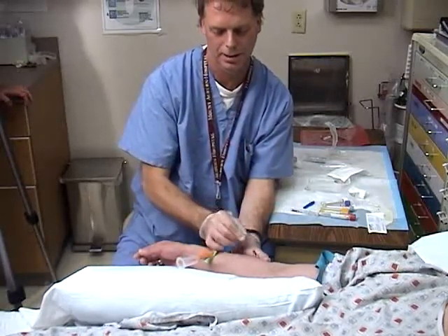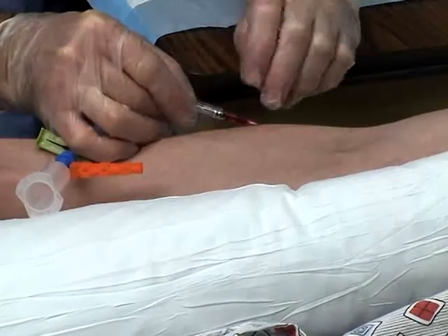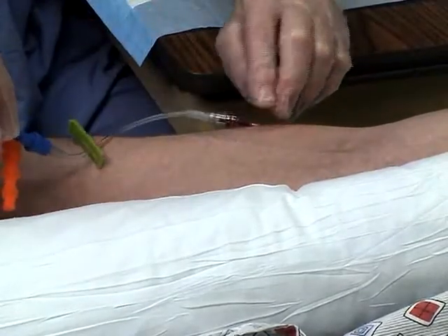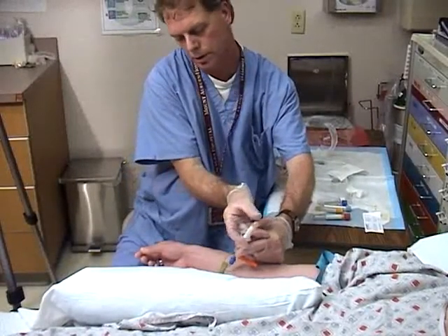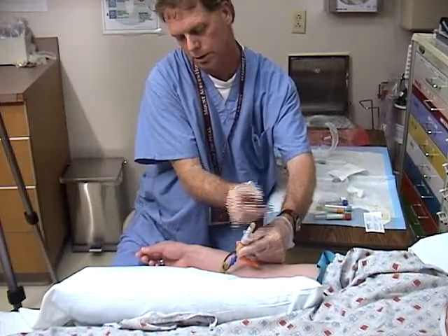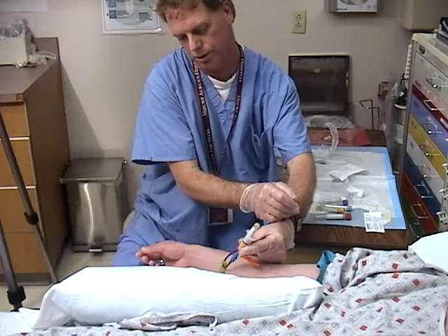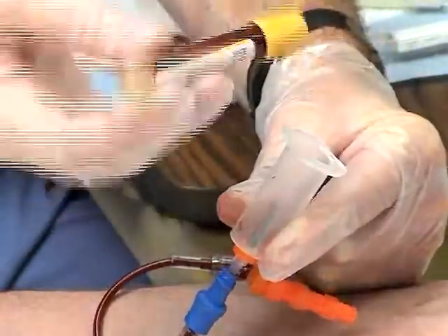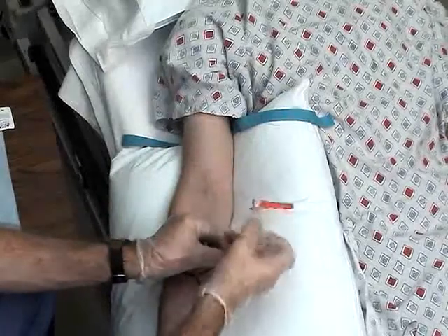In this demonstration, a section of extension tubing is used. It is also possible to directly connect the intravenous tubing to the hub. Be familiar with the standard practices at your institution. If phlebotomy is required, attach a vacutainer holder directly to the tubing and then insert the required vacuum tubes into the holder. Blood flow will stop spontaneously when the tubes are full. Once phlebotomy is complete, release the tourniquet and remove the vacutainer holder from the tubing.